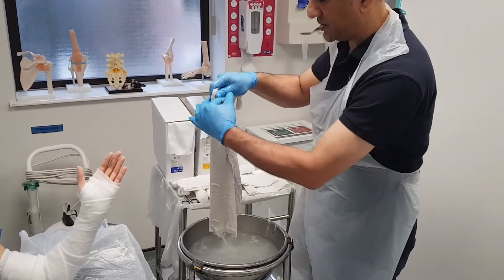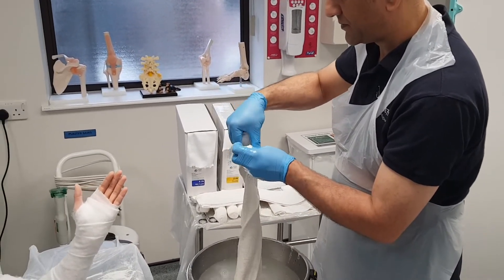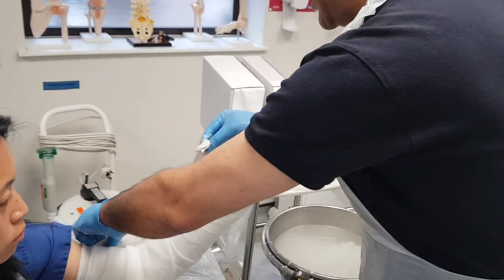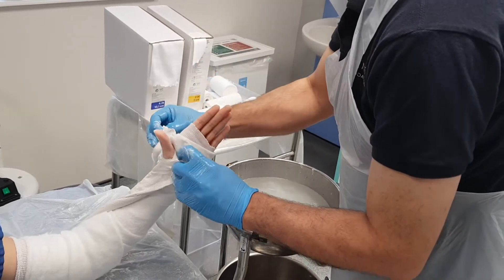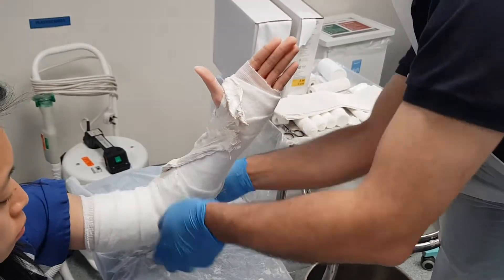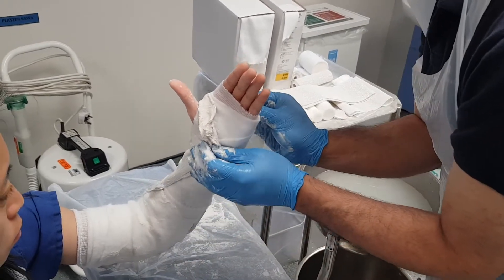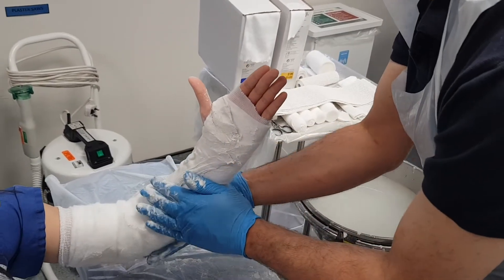I'm going to squeeze the excess water out. I'm going to apply the plaster to the radial side and wrap it around the back and underneath the elbow. I'm going to use my palms to try and smooth it down rather than my fingers so I don't leave any indentations.